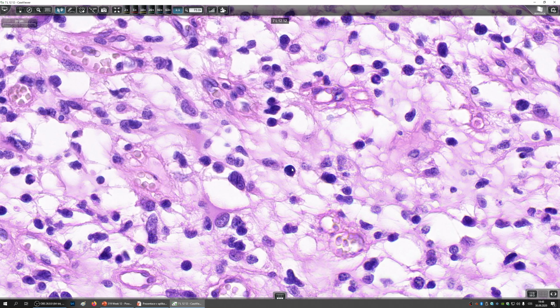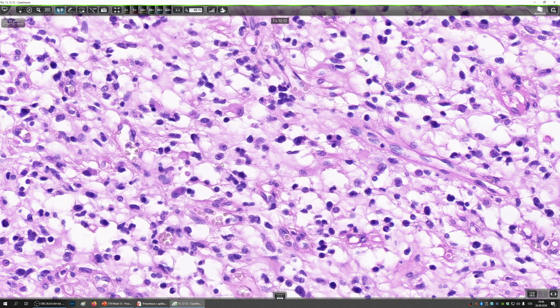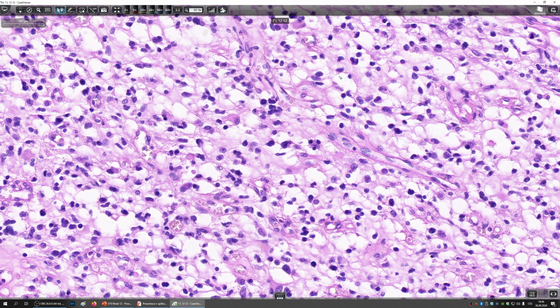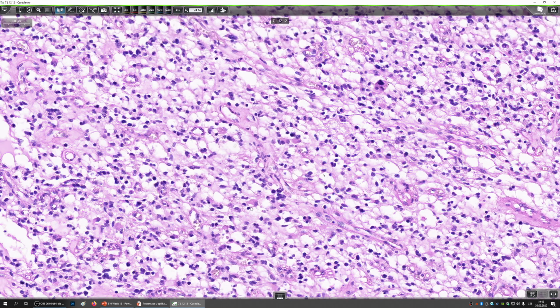This is a lymphocyte, these are neoplastic glial cells. So all these slightly atypical cells, they are all glial cells with astrocytic differentiation. WHO grade 2 tumor. These cells are positive with GFAP or glial fibrillary acidic protein. That's the marker that we use.